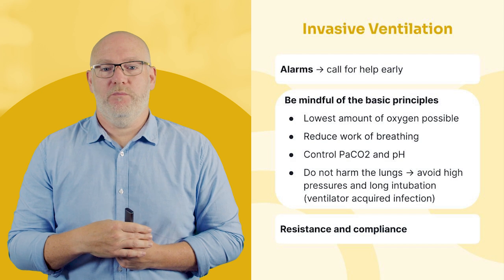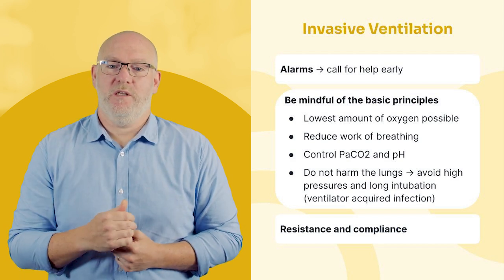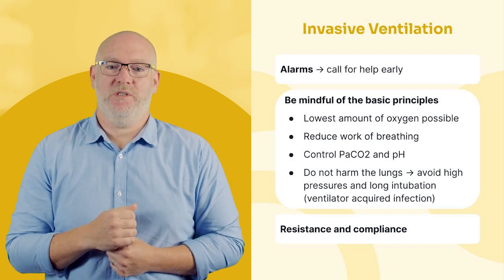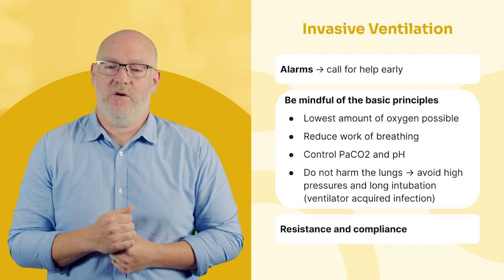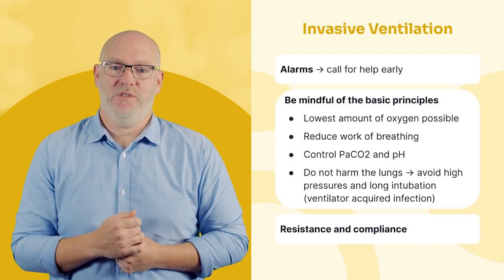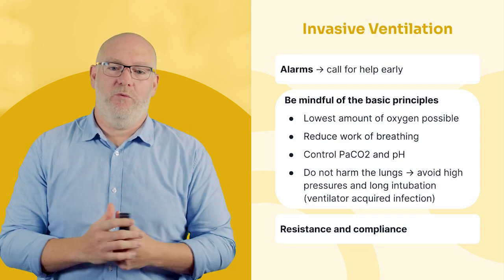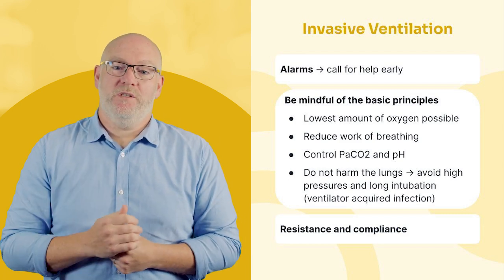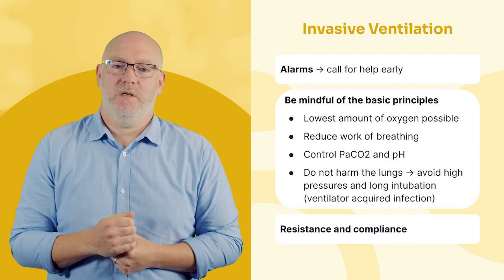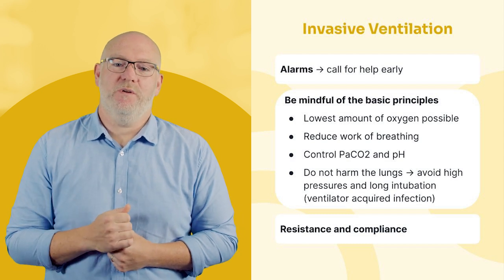We're aiming to reduce the work of breathing. We're aiming for control of that PaCO2. All patients who are ventilated in Australia and New Zealand now need to have their end-tidal CO2 continuously monitored. So yes, we're taking blood gases often to monitor and titrate things, but we need to be continuously monitoring their end-tidal CO2 as well. By controlling the person's CO2, we're maintaining a normal pH for them. We're conscious to do no harm, so we're avoiding those high pressures, particularly high plateau pressures. And as soon as possible, we're thinking at all times, does this person still need to be intubated?